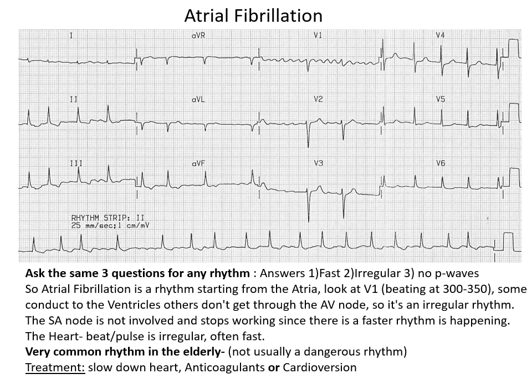And do you see clear P waves? Don't forget, sometimes you can confuse a T wave for a P wave. If you look in V4, you'll see that there's T waves that are clearly showing up after the QRS, but there's no P waves before. So if we look through these different leads, there's no clear P waves. Okay, so this is what's called atrial fibrillation.